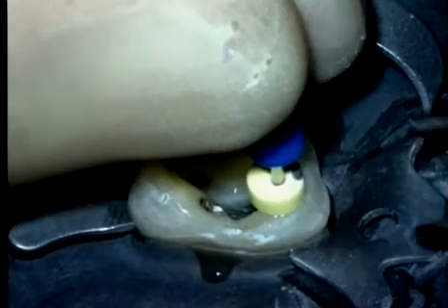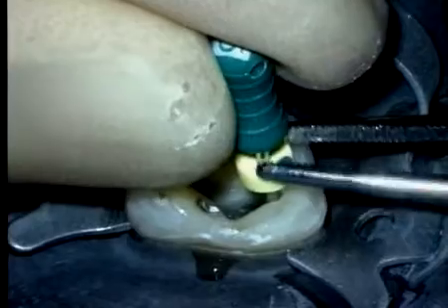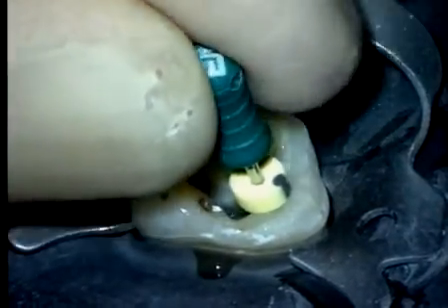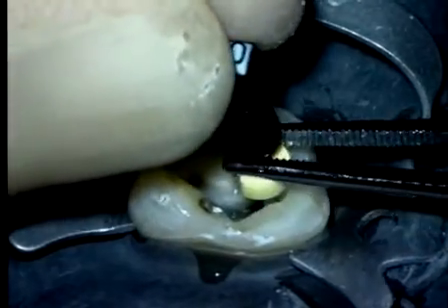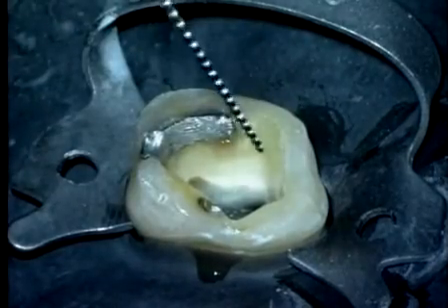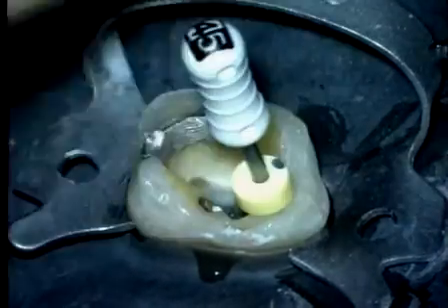Tuning is the clinical exercise where each sequentially larger instrument is placed into the canal. When the handle is snug, the rubber stop is pushed down on the reference point. Recall the 35 through 60 hand files are nickel titanium. These highly flexible instruments will be easily inserted into the canal. When the handle is just snug, the assistant pushes down the rubber stop, and we can begin to see more gap between the top of the stop and the plastic handle. This again reassures us that each larger instrument is moving further and further away from the terminus.